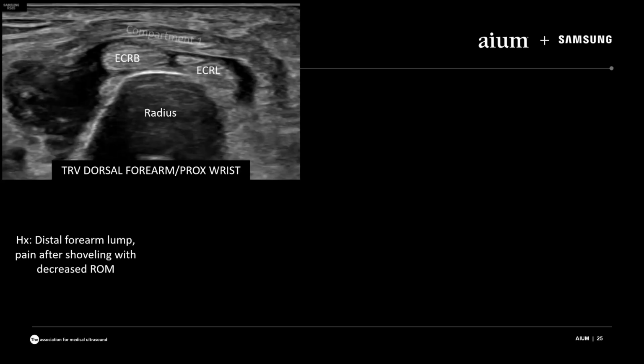And then this is the compartment 1 tendon. Here's the muscle of compartment 1. So this is the musculotendinous junction. And that, again, will normally cross over as compartment 1 heads radially towards the thumb. But what's different about this? Well, you can see the tendon is very thick and heterogeneous compared to the normal compartment 1 tendon. And there's also some fluid deep to that tendon surrounding these compartment 2 tendons.